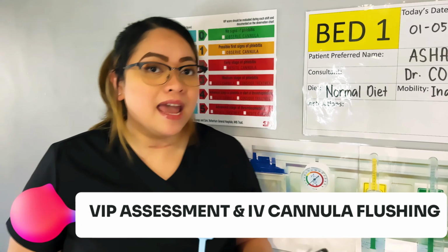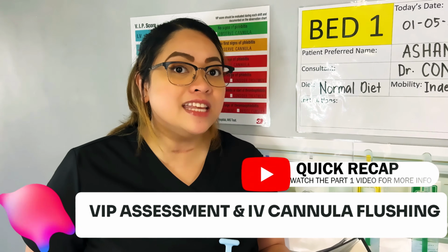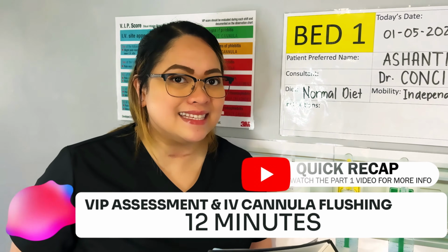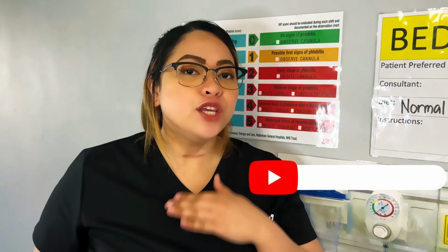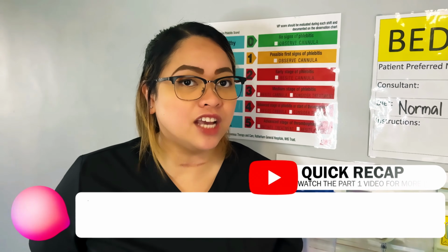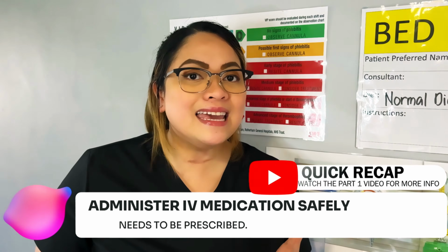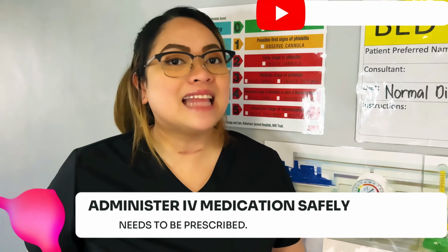VIP score and IV cannula flushing is one of the new skill stations in the OSCE exam. You have to do this procedure within 12 minutes. And that's what I'm going to show you all today. In order for you to pass, you have to administer the IV medication safely. Yes, you heard me. IV flushing here in the UK is an IV medication administration. That is why it has to be prescribed.